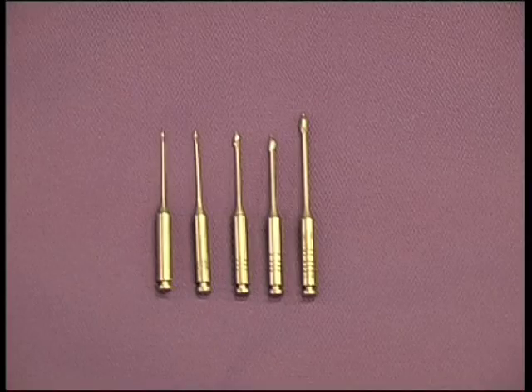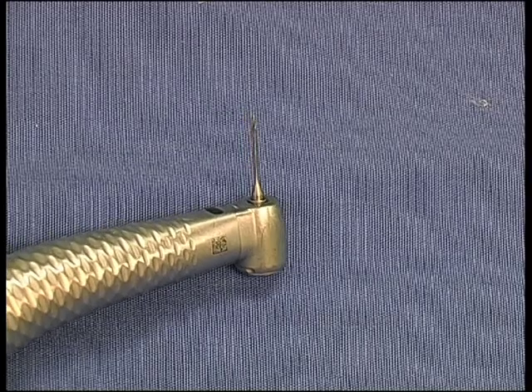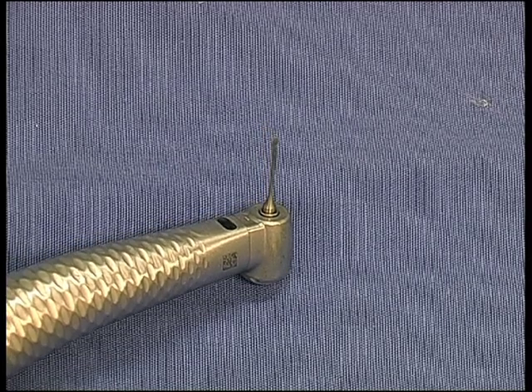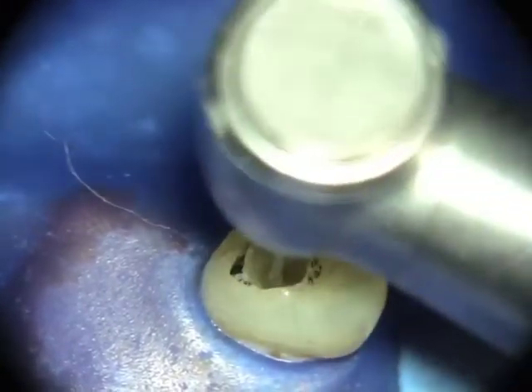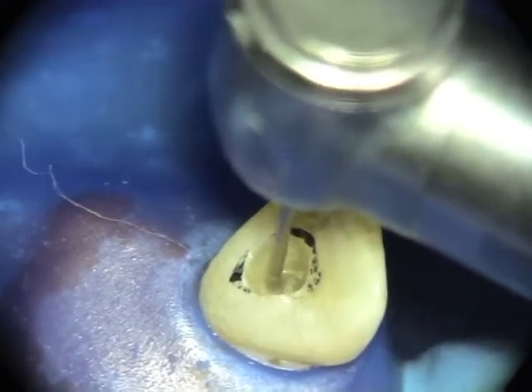The coronal part of the canal is now flared to permit easy access of instruments and irrigants into the canal. The largest Gates-Glidden burr that will fit passively into the canal orifice is chosen and gently placed within it. This is a Gates-Glidden number 4. The burr is used around the circumference of the canal with a gentle upward brushing action.